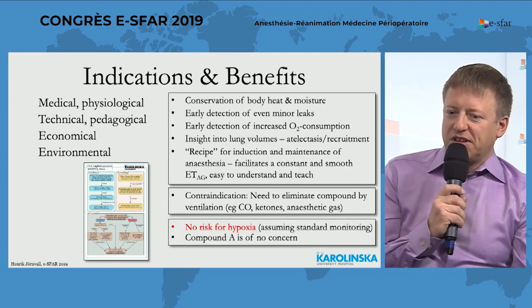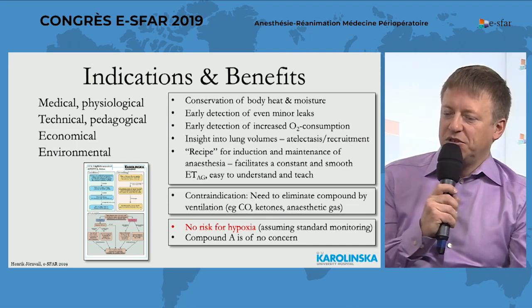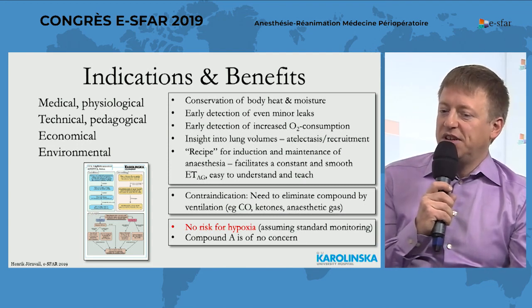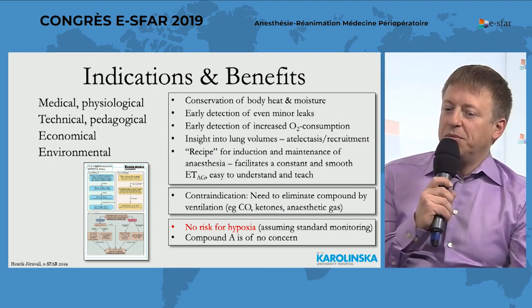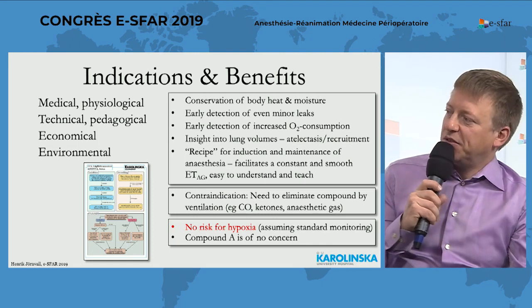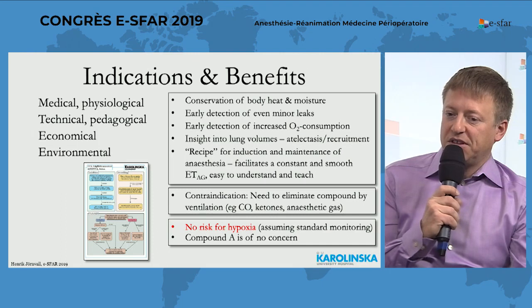And also, I want to say that there is no risk for hypoxia. There is absolutely no risk for hypoxia. There is no difference whatsoever in what the patient receives, assuming, of course, standard monitoring, which we all have in all anesthesia throughout the world. And also, I want to say compound A is of no concern. That could be a lecture on its own, but there have been more than 1,000 million, so 1 billion sevoflurane anesthesias, and there has been shown no kidney side effects from this.